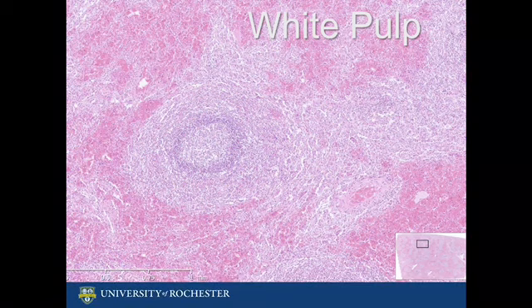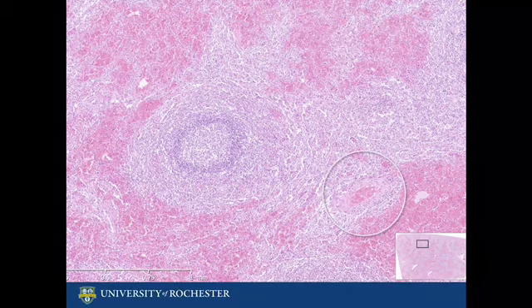The white pulp consists mostly of lymphocytes and other lymph tissue. Generally, lymphocytic T cells aggregate and form para-arterial lymphoid sheaths that surround the spleen's central arteries, whereas lymphocytic B cells form lymphoid follicles that form adjacent to and stem off the central arteries.